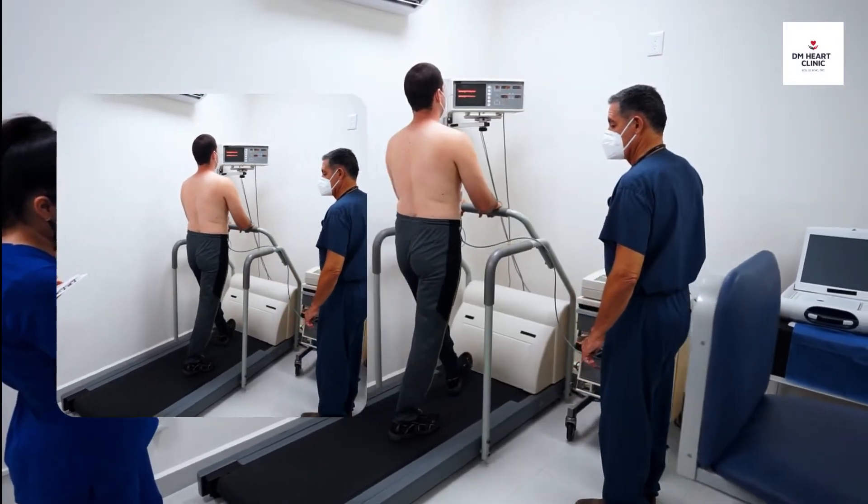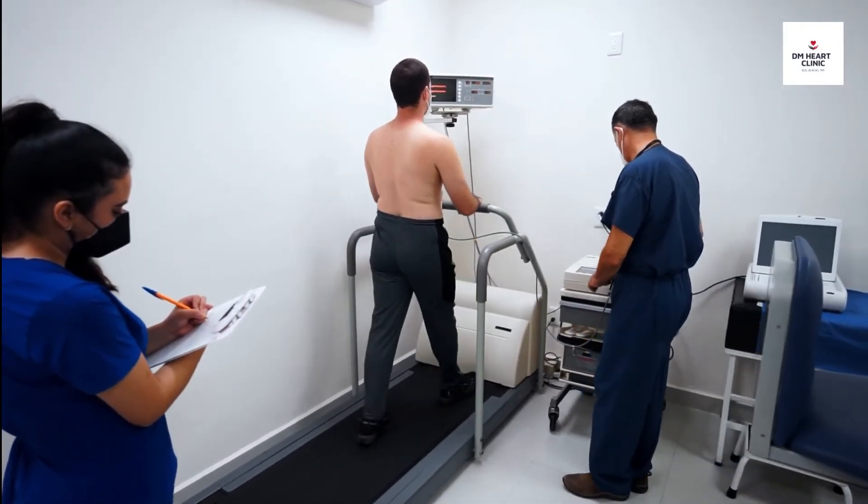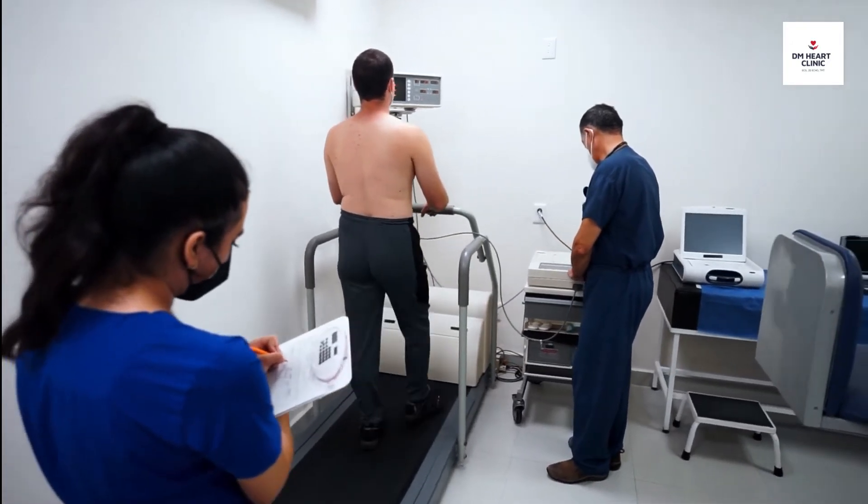You can utilize the railing on the treadmill for balance, but don't hang on tightly, as this may affect the TMT test results.